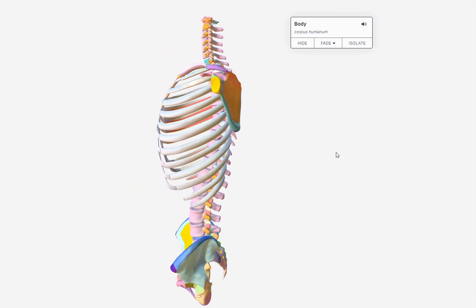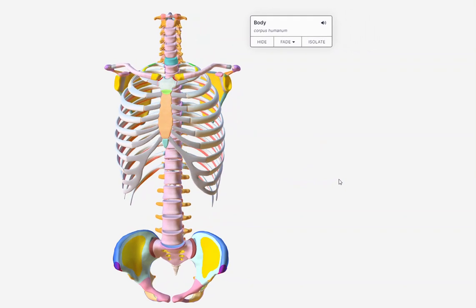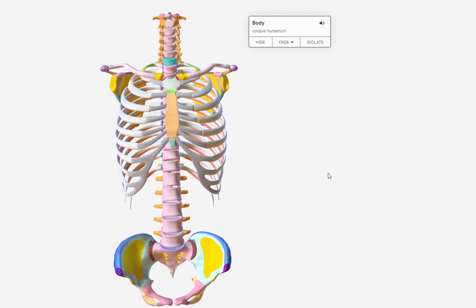The projection in laterals is considered lateral. This would be considered a lateral projection beam. It's going to enter one of the lateral sides and exit the other lateral side. So we just call it a lateral projection. On the torso, that's how we refer to it. It gets a little bit more complicated with the limbs when we start doing the limbs.